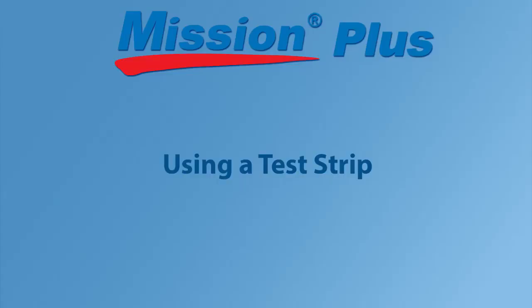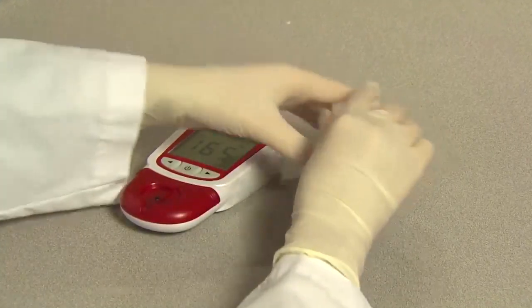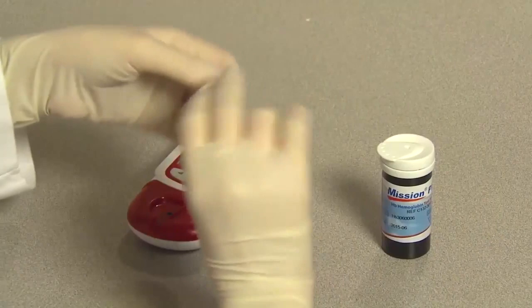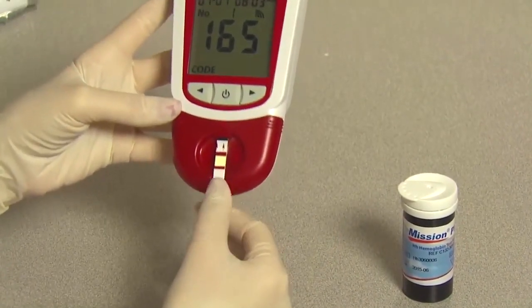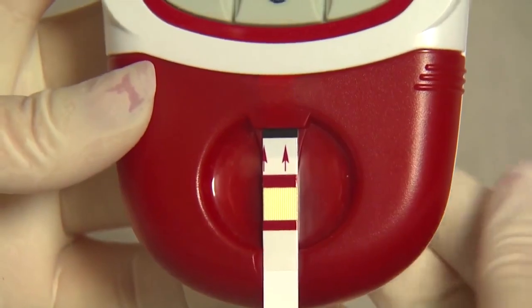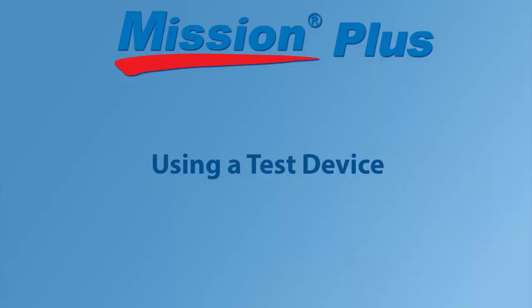Using a test strip. Turn on the meter. Open the canister and remove one test strip. Make sure you recap the canister after you're done. Firmly insert the test strip into the strip channel in the same direction as the arrows indicate on the strip. Ensure that the test strip is inserted all the way to the end of the channel. The blood drop symbol will flash when the meter is ready for the specimen to be applied.